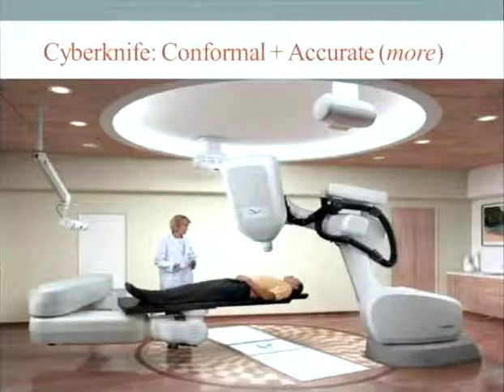Well, when we're talking about conformality and accuracy, you really can't beat the Cyberknife radiosurgery system. I showed you the picture of that large linear accelerator. That linear accelerator is truncated into this treatment head, which provides the radiation source. It's attached to a robot. There are 2 KV imaging cameras on the ceiling and a camera here that is unique. This is able to track the patient's respiratory pattern during therapy.